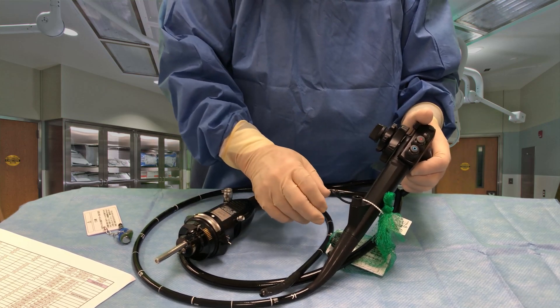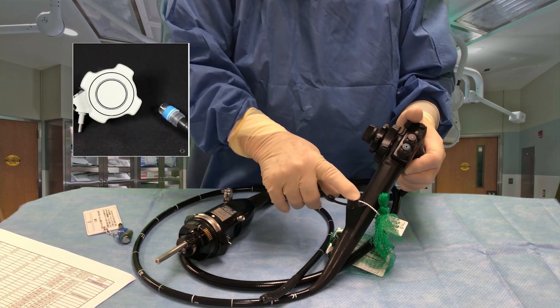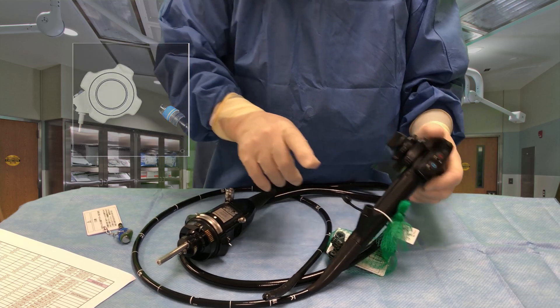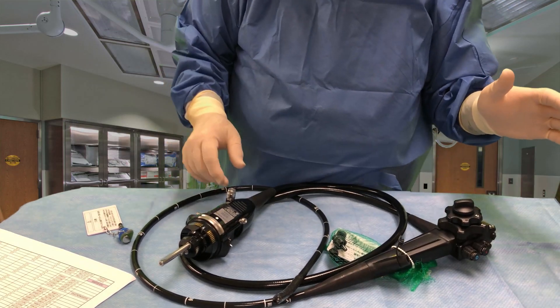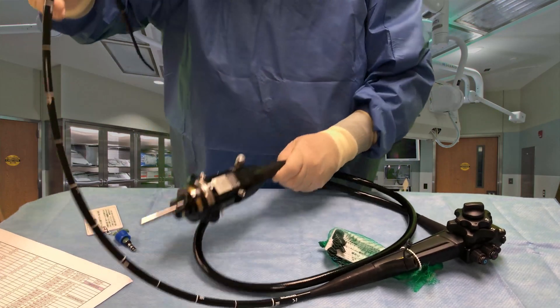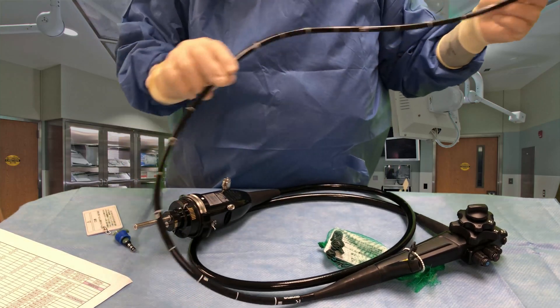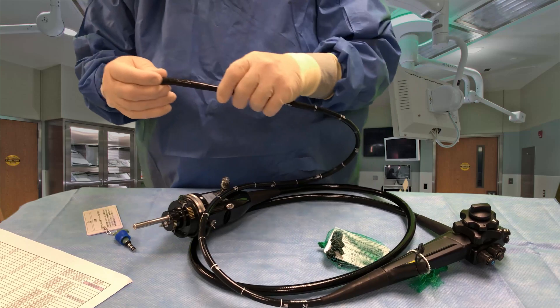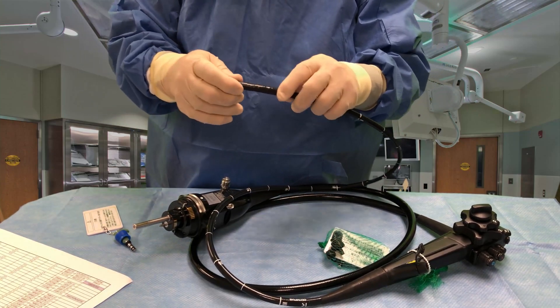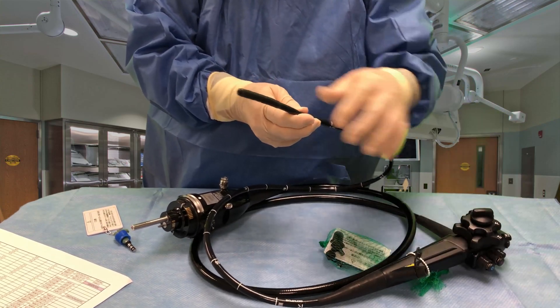If I pop this open, I can find a bander handle on here if I'm going to be doing any banding of esophageal varices. We have an insertion tube here. The insertion tube or working length is around 103 centimeters. You can see it's graduated, and then we have the bending section here that is very flexible.